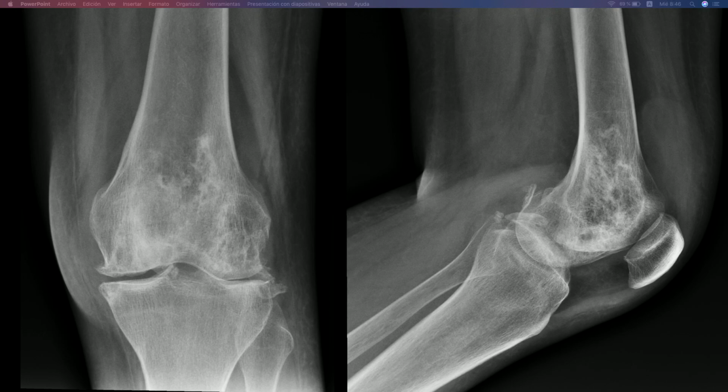AP and lateral radiographs were taken of the left knee. The AP shows degenerative changes like joint space narrowing with predominance of the medial compartment. There's also lateral compartment involvement, and we can see marginal osteophytes, lateral and posterior osteophytes. Also, we can see subchondral femoral cysts and some varus, no, it's valgus deformity of the knee. And all these findings are consistent with osteoarthritis.